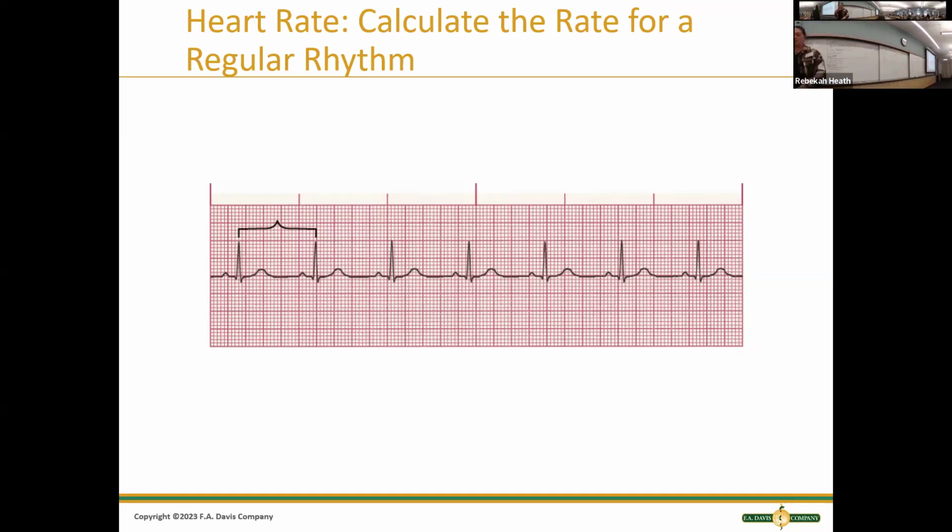Go really quick to that other page that had A fib. Ventricular tachycardia. That's on the back page. You don't have to measure anything. I just want you to count. How many big QRS complexes do you see on that page?